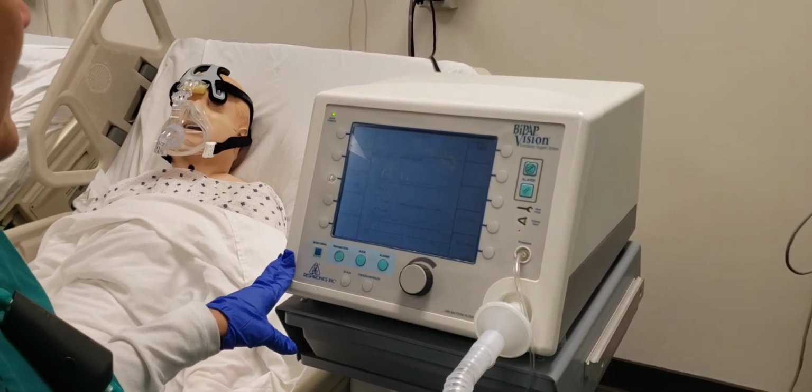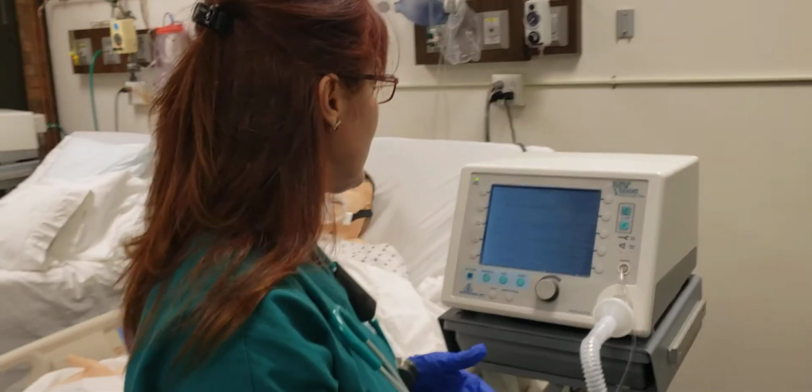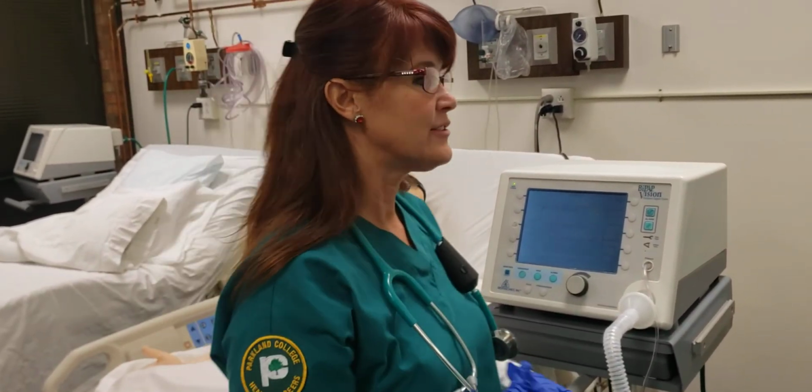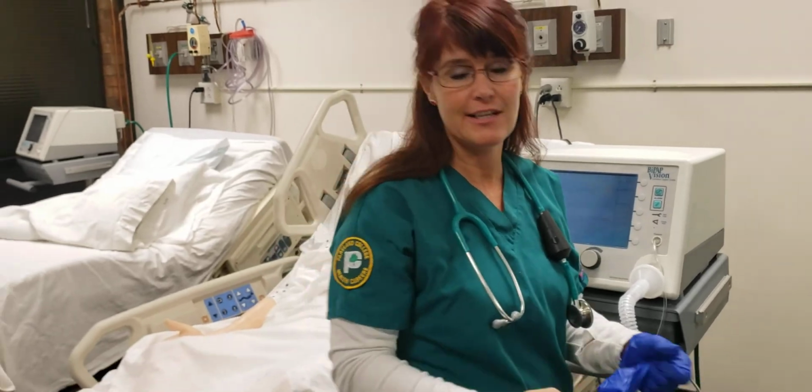The next thing that you want to do is assess your patient. You want to check their SpO2, their heart rate, just generally make sure everything's going okay. Then you go back and document this in the patient's charts, and you tell the nurses and stuff what's going on. And then, of course, perform proper hand hygiene as you exit the room.